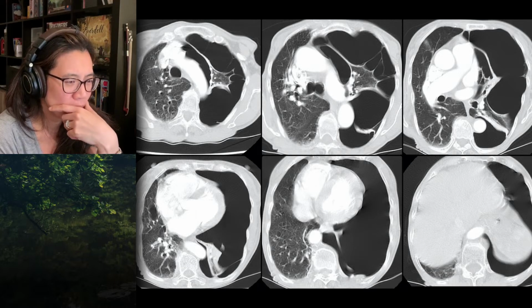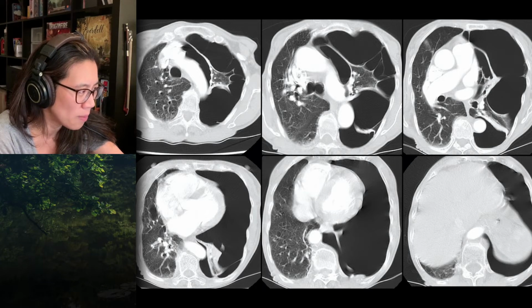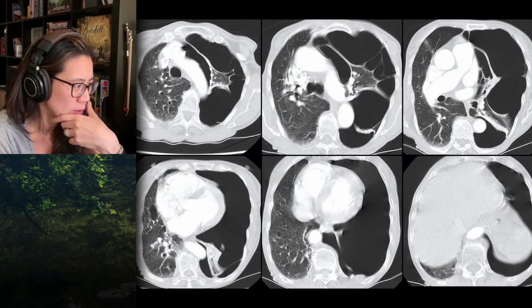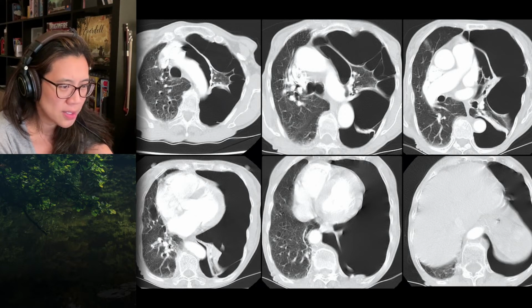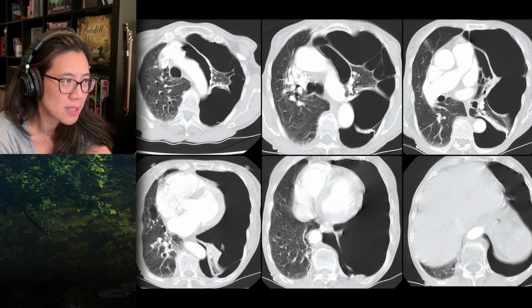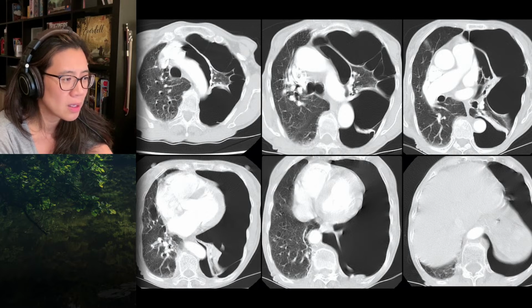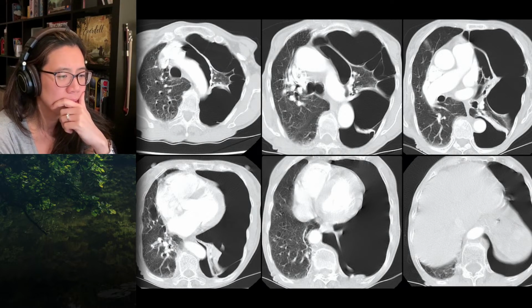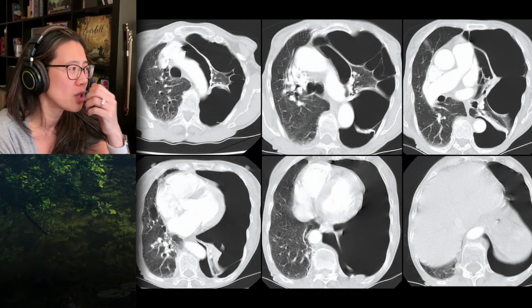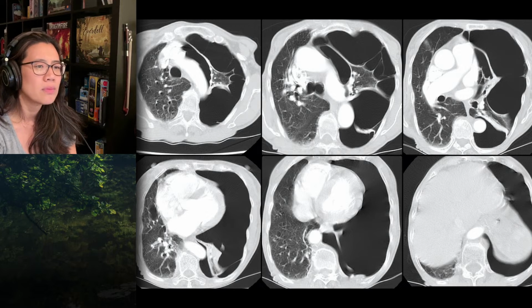So as we go down to the bottom, I can see collapsed left lower lobe on the image in the bottom left-hand corner of the screen. And then as we go down lower, I don't see any of those septations like I do in the superior portion. So at the bottom, it looks like you're below all the lung, therefore I think that's a tension pneumothorax then. It's a tension pneumothorax. And so she's got pleural adhesions. So these patients have had some sort of disease in the past.